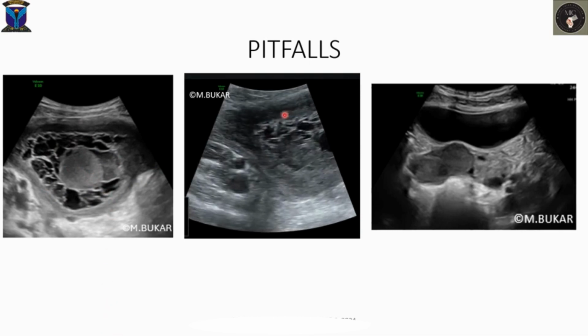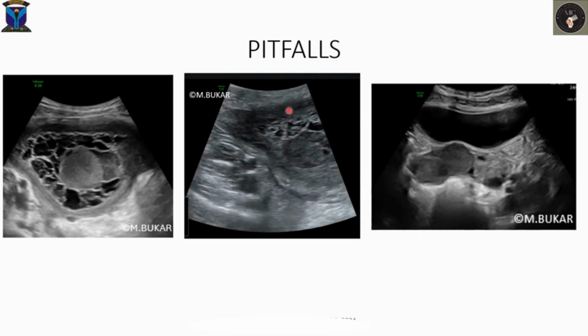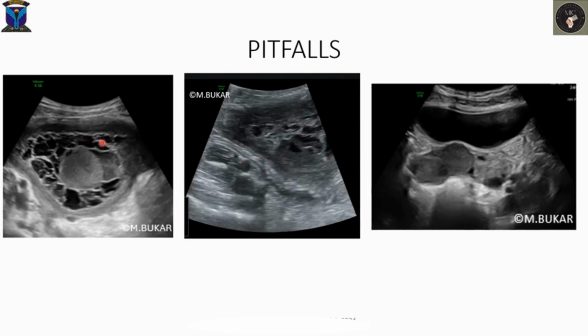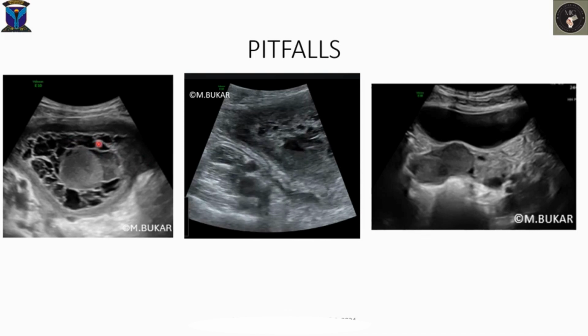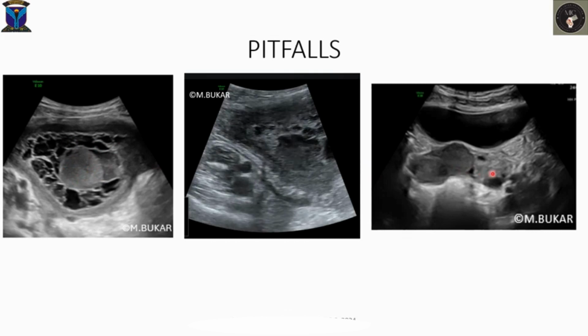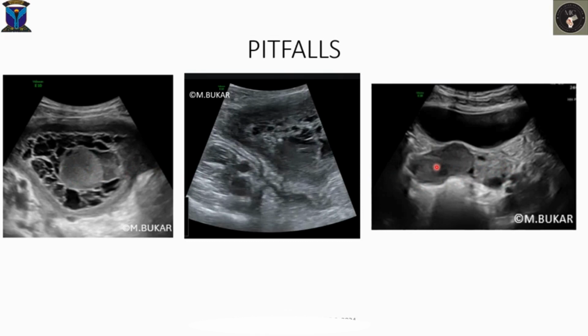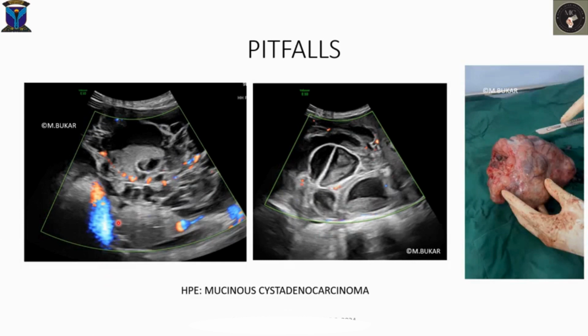How did you know that? Look at my needle here, trying to aspirate, and here I obtain yellow colored fluid, but here was actually frank pus. 3 months after antituberculosis treatment, look at the ovary, look at the residual lesion. Patient has already completed treatment and is doing well.